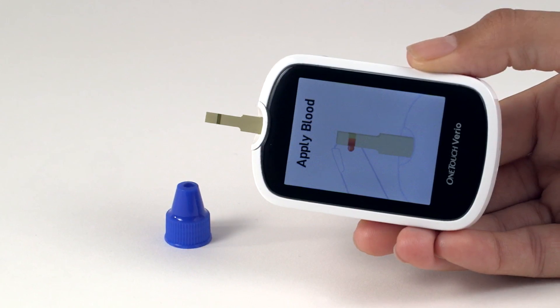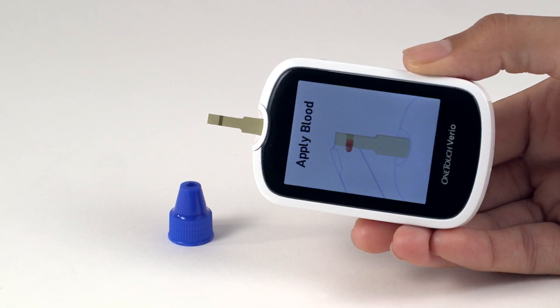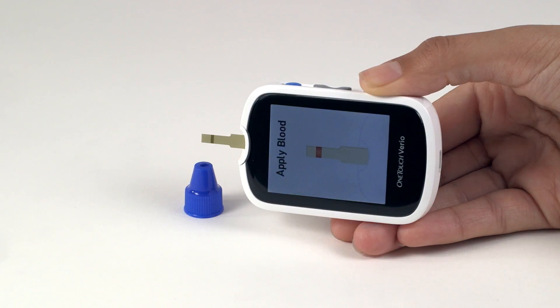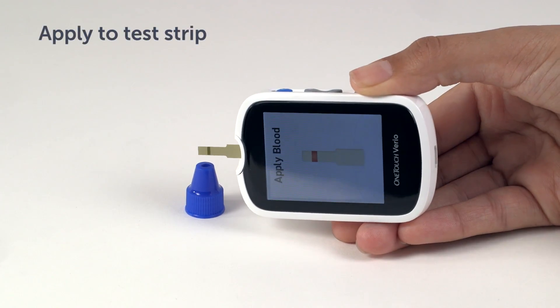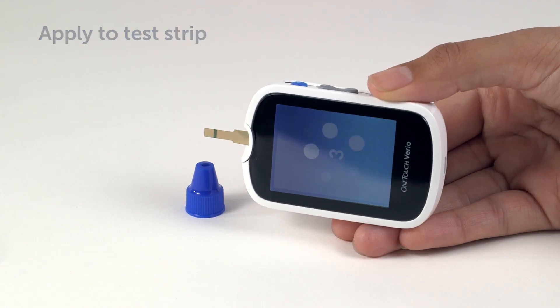Hold the meter so that the edge of the test strip is at a slight angle to the drop of Control Solution. Touch the channel on the side of the test strip to the Control Solution. Wait for the channel to fill completely. The meter will count down from five to one.